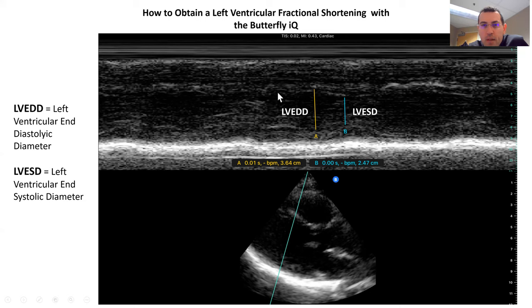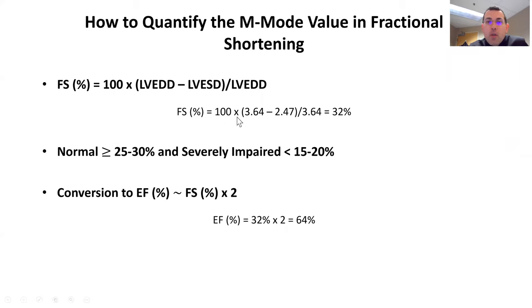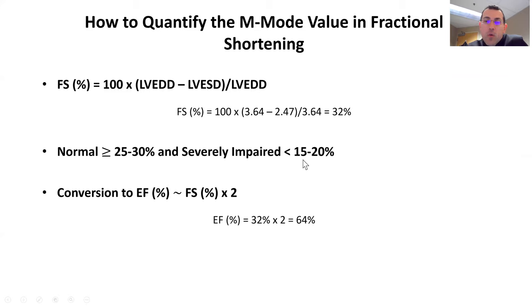We follow the tracing and find an area of relaxation to take our left ventricular end diastolic diameter, then find an area of contraction between the anterior and posterior walls to draw a line and get our left ventricular end systolic diameter. The values here are 3.64 and 2.47 centimeters respectively. Plugging into the equation: 100 × (3.64 − 2.47) / 3.64 = 32%. Converting: 32% × 2 gives an ejection fraction of 64%.